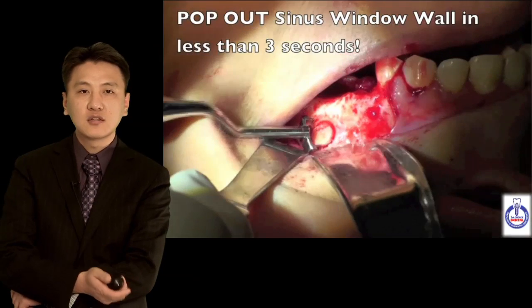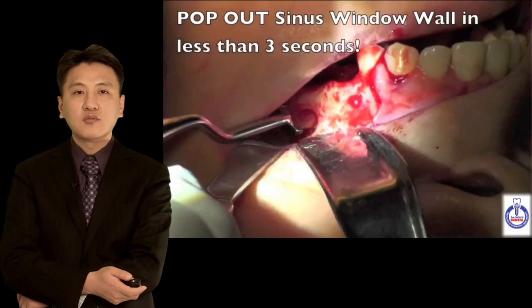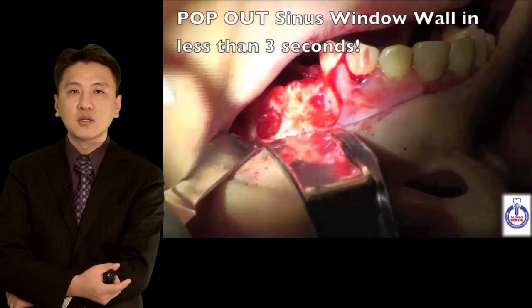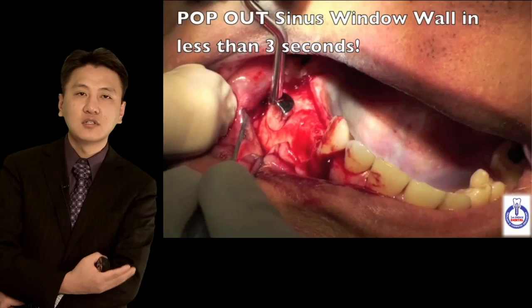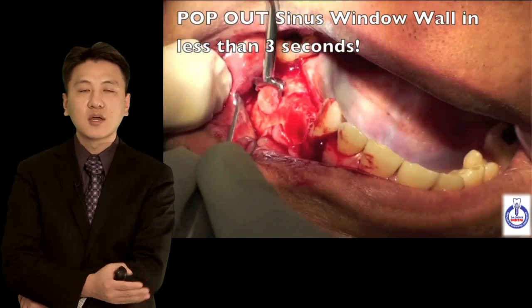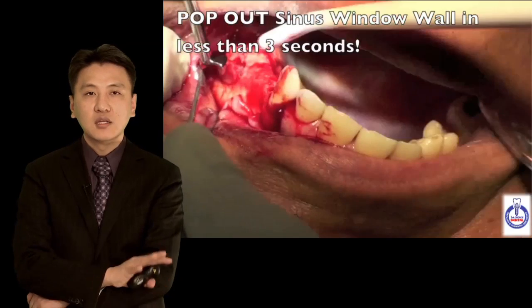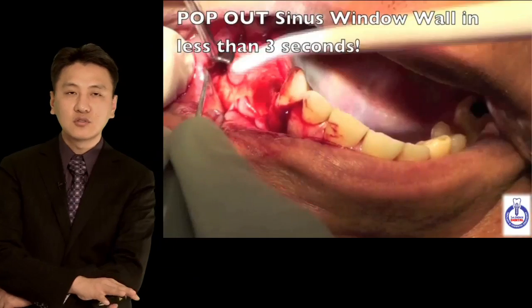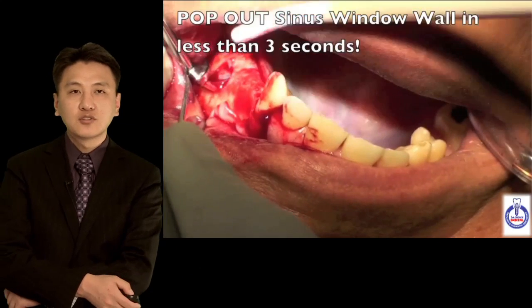As you can see in this video, the sinus wall can be opened in less than three seconds. Furthermore, after lifting the Schneiderian membrane, it can be placed back into the original location.